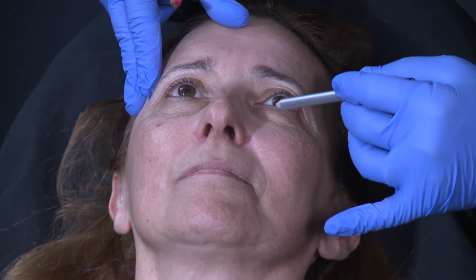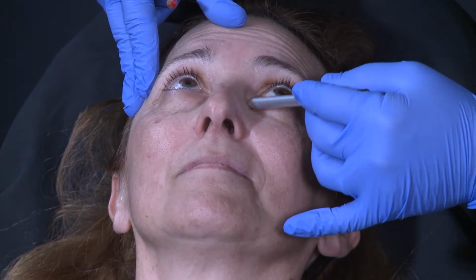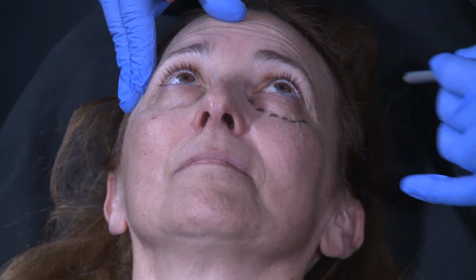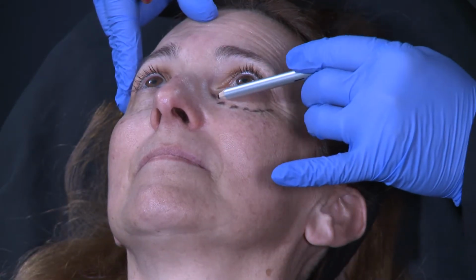So here, you see very well for this patient, if she looks up, you see the depression here, that is the tear trough, and here also you see the palpebro-malar groove. So this is what I will inject. Where are the dangers? The dangers, if you turn a little bit the head of the patient, you see a little depression here. That is the nasojugal groove.